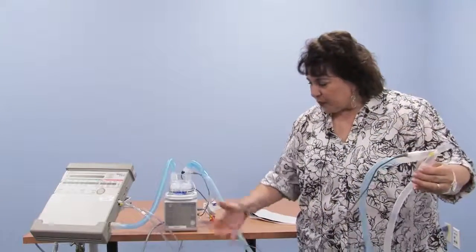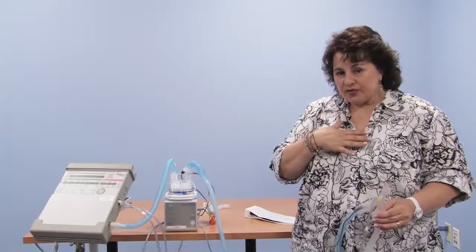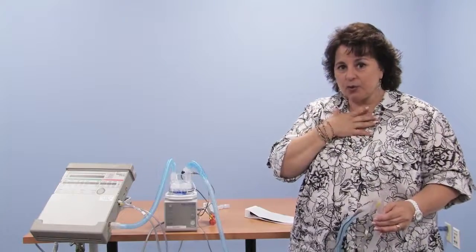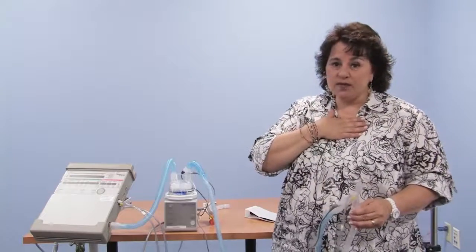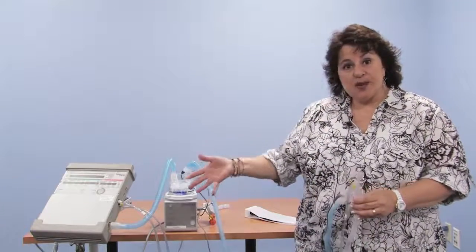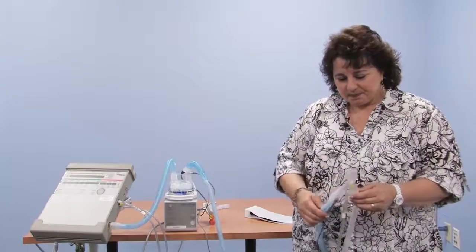This would be the one that would provide heat and moisture for the tracheostomy tube, reduce secretion thickness and potentially the chance of plugging of the tracheostomy tube while on support. When you don't have heated moist air going into the trach, then the lungs have to give up moisture and heat to try to achieve that 98.6 that the body wants, fully saturated with water. So that's why during the day, when you may not be on the humidifier but using other methods of humidification, which we'll talk about, the child may have thicker secretions.